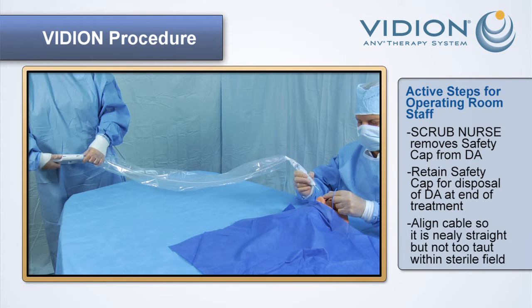Align the cables so that it is nearly straight, but not too taut, when preparing for device deployment, just prior to beginning the procedure. Keep the device components within the sterile field when doing this. At this stage, please be aware of the following warnings.